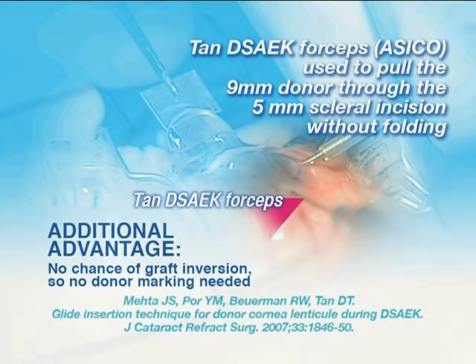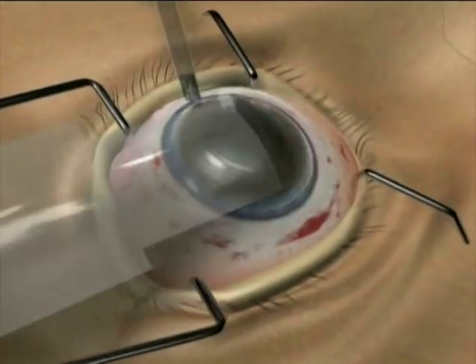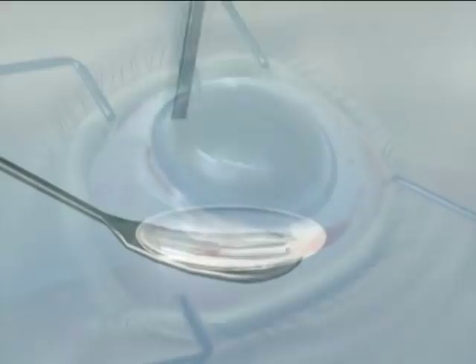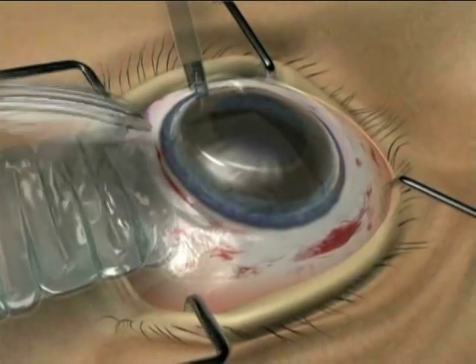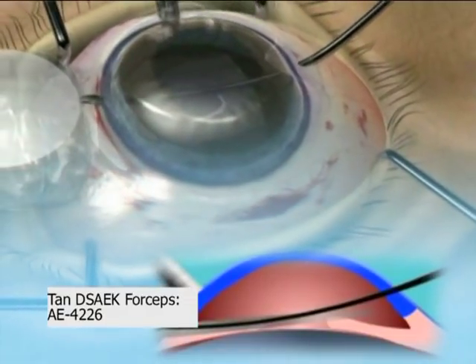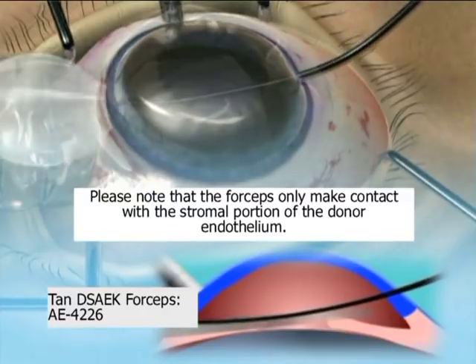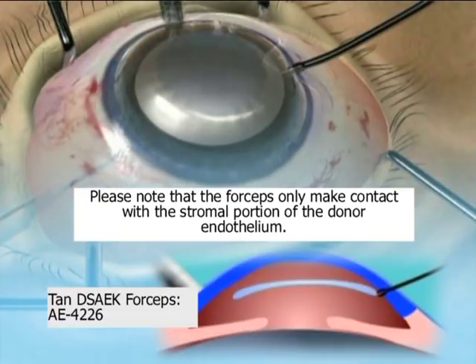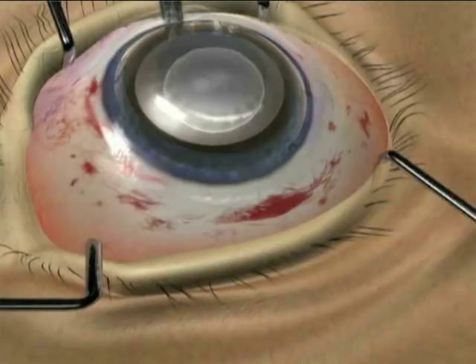In this animation, the sheet glide is first trimmed slightly to slide through a 5 mm scleral incision into the AC. Viscoelastic is used both on the glide and on the donor endothelial surface, and the donor is placed onto the glide. The Tan DSAEK forceps is then inserted across the AC, emerging out through the wound to grasp the donor, which is then simply pulled in a slightly upwards direction into the eye. The glide is then removed, and injection of a small air bubble prevents descent of the donor onto the iris.